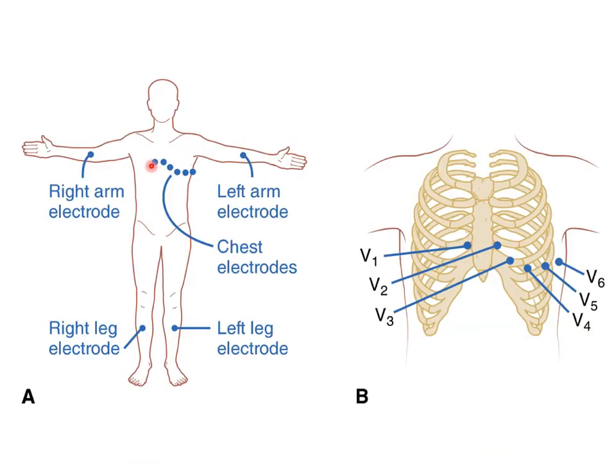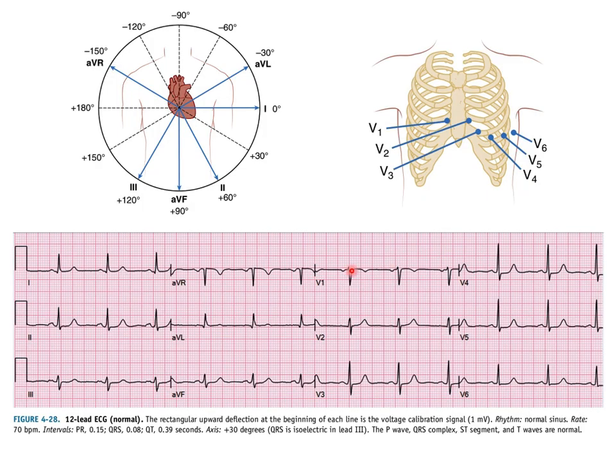And then there are separate detectors on the chest wall that are placed across the chest wall. And V1 through V6 are these detectors here, the little patches. And so you're basically mapping the voltage as you go around the chest from just on the right side of the sternum to just the left, and then around to not all the way around the back, but just almost. And so those are V1 through V6, and they happen here, V1, 2, 3, 4, 5, and 6. Okay.